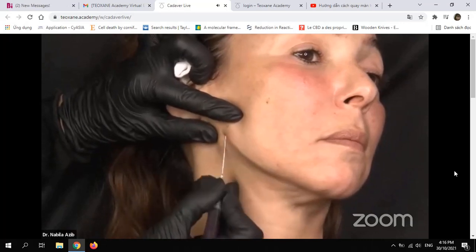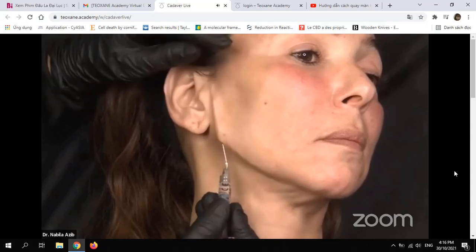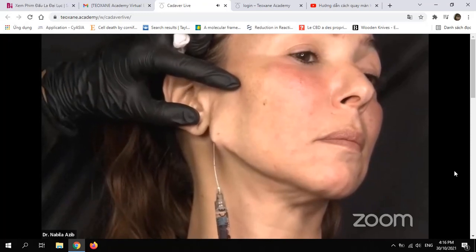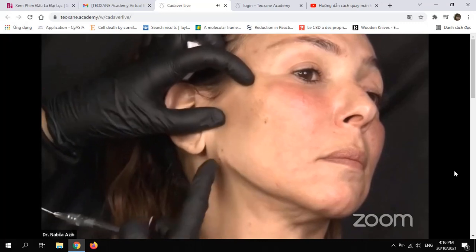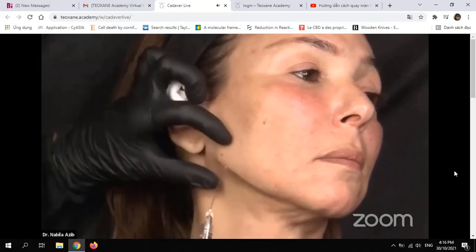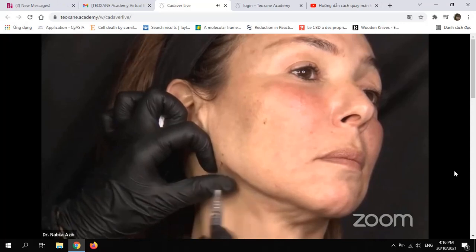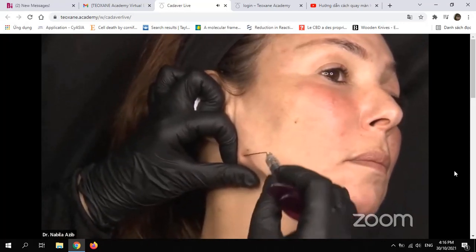But usually, even in male patients, I use RHA 4 in the superficial layer. So look again here, I'm superficial with an angle. Yes, we can. And I lose a little bit of product in my entry point. Some of my patients like to have a very well-defined angle also. So this is another tip. Look, I place my index and my thumb like this.